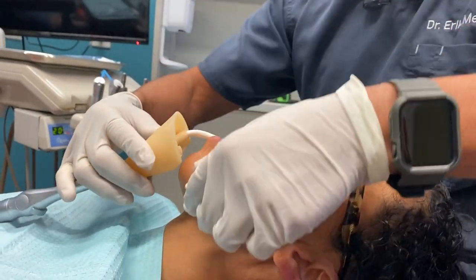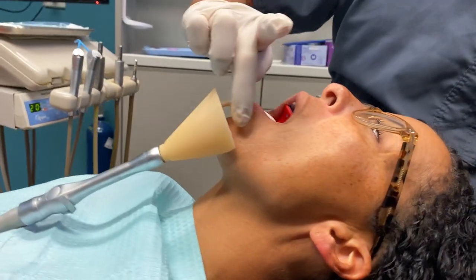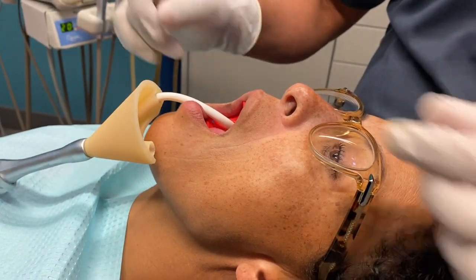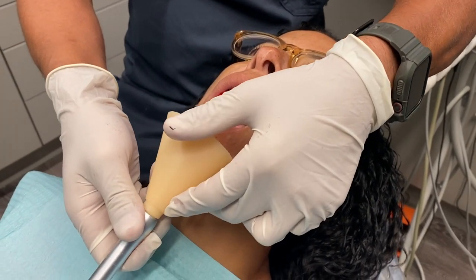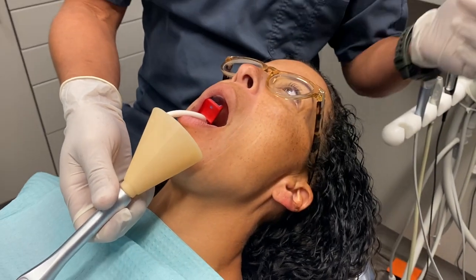But typically I like the five. Lift your chin. That's going to give you more of an under-the-chin type of situation where maybe if you want lower anterior access you have better lower anterior. But personally I like the five inch, which puts you a little bit higher, closer to the mouth. But it's pure preference.